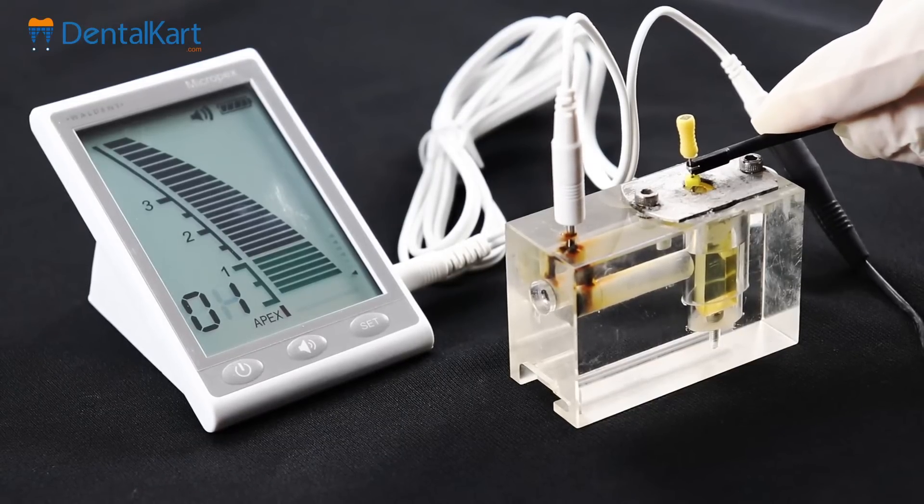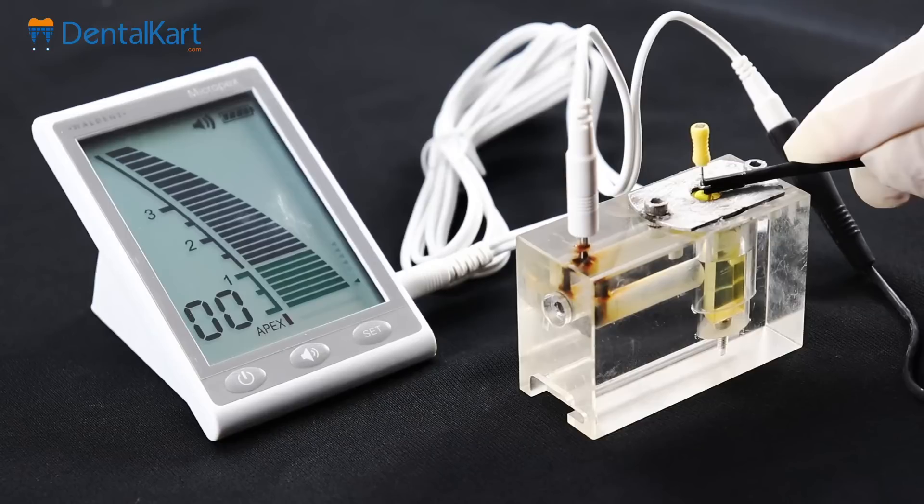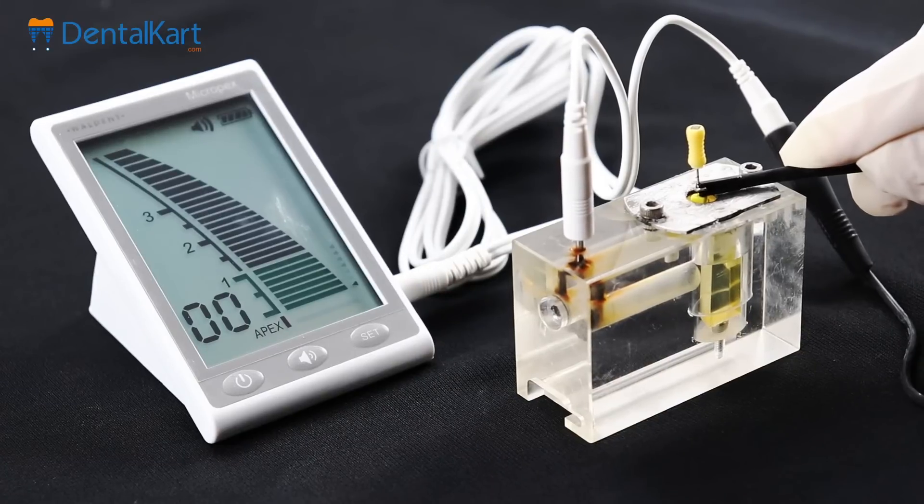When the displayed value is zero, the bar transitions to a green pillar, indicating that the apex has been reached. Furthermore, the accompanying beeping audio signals become frequent and pronounced. As the file tip goes beyond the apex, the flashing of the bars ceases, leaving them continuously lit, and the displayed value becomes negative.